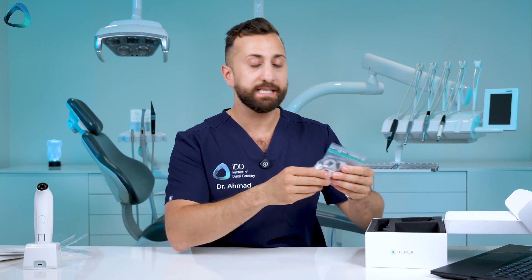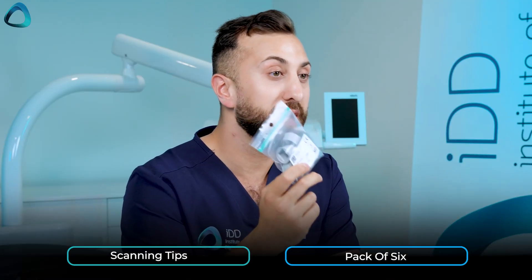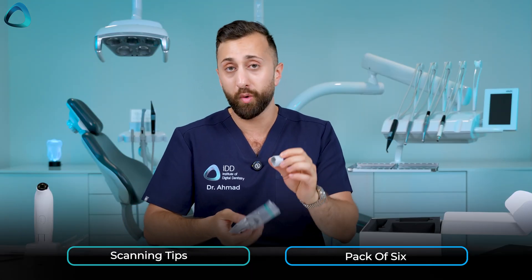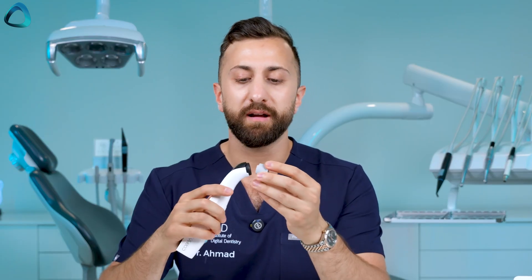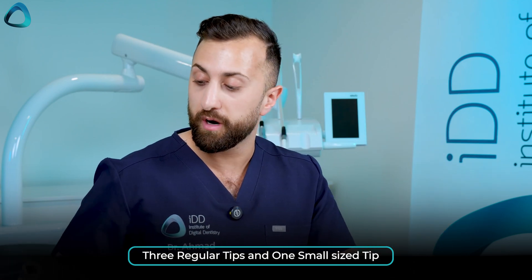Beneath that we have the scanning tips — a packet of six sterilizable scanning tips that clip onto the Borea Cobra. You must use these tips when using the device; they clip on with a tight rubber fit. In the box you get six tips total — five extras and one kept on the Cobra itself.